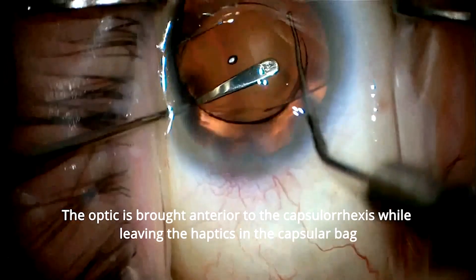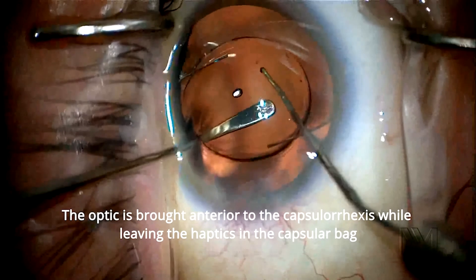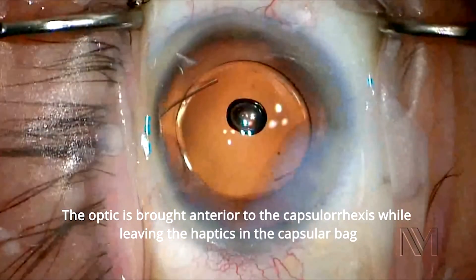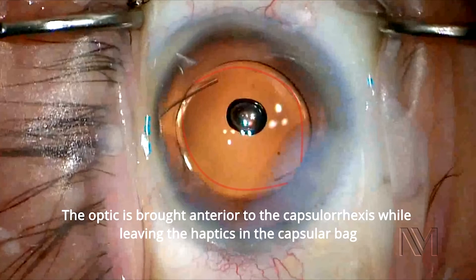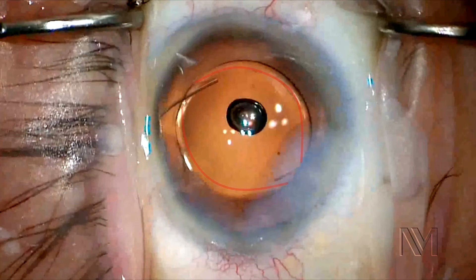A Kuglen spoon was constantly placed behind the optic to levitate it forward, because the optic has a natural tendency to prolapse back into the capsular bag. The red line helps detect the location of the capsular rhexis margin after reverse optic capture.